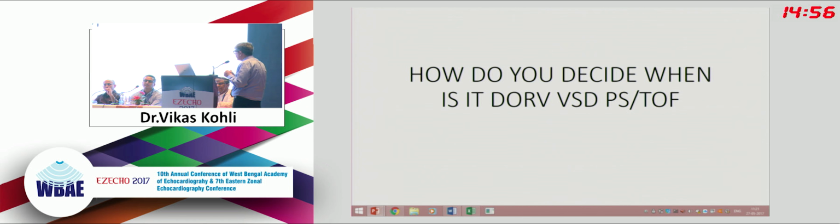Just a word about DORV and how do you differentiate, and when would you say it's DORV? This is a common question. Whenever you do an echo, whether it is a tetralogy or a double outlet right ventricle, most commonly we decide whether there is more than 50% override or less than 50% override. If it is more than 50% override, then the aorta is mostly committed to the right ventricle, and it is a double outlet right ventricle.